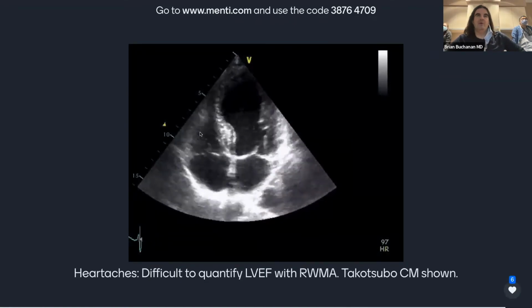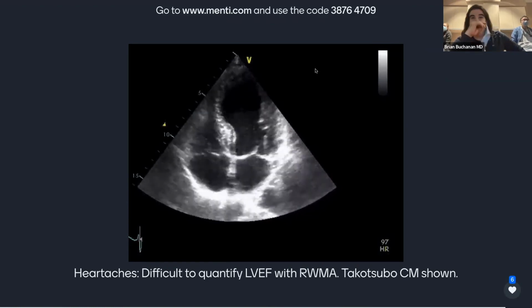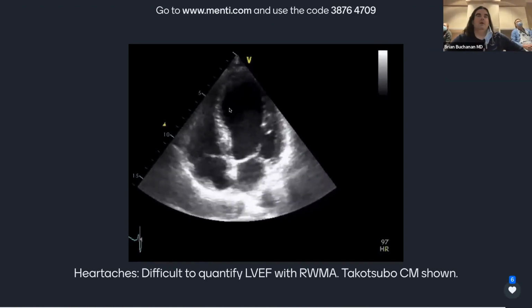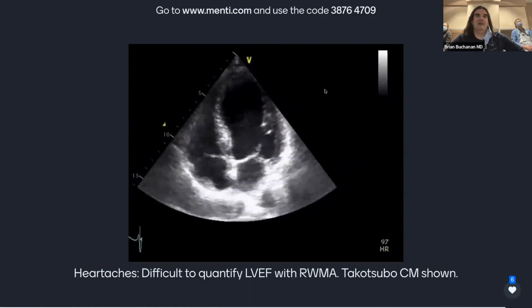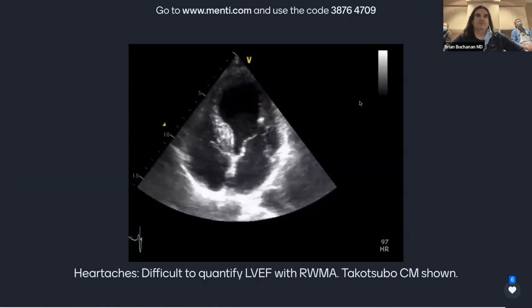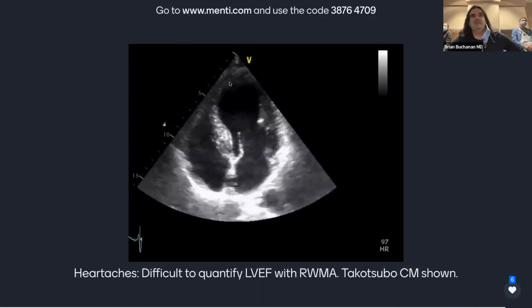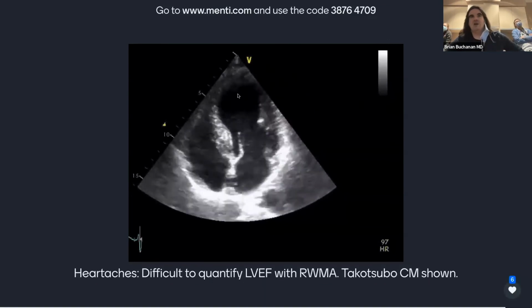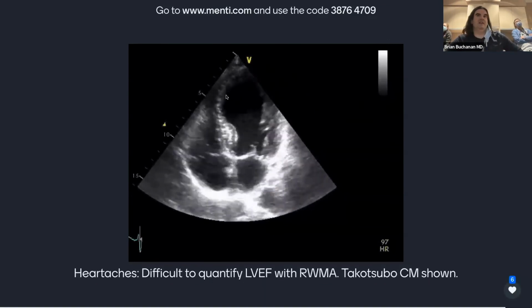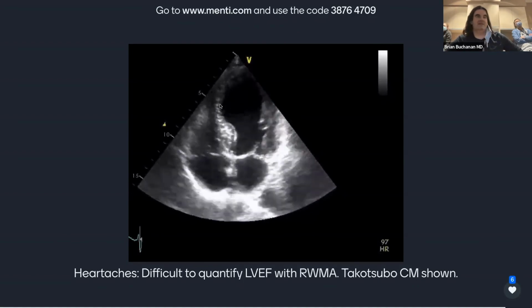So just be mindful. These patients can also have one other problem that can be life-threatening, which happens because of their wall motion abnormalities. Any ideas? Thrombus, exactly. With this degree of akinesis at the apex, the blood will swirl there. If you had a better shot of this LV apex, you would see that the blood is not moving very much, and it's probably creating little eddies in the apex of the left ventricle.